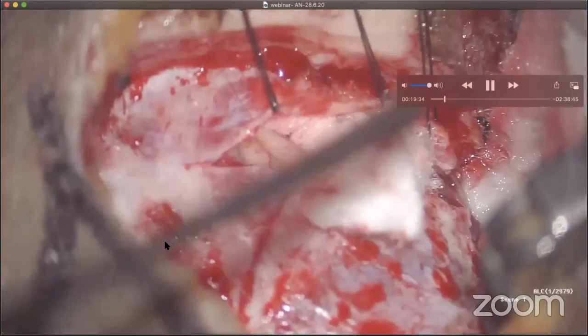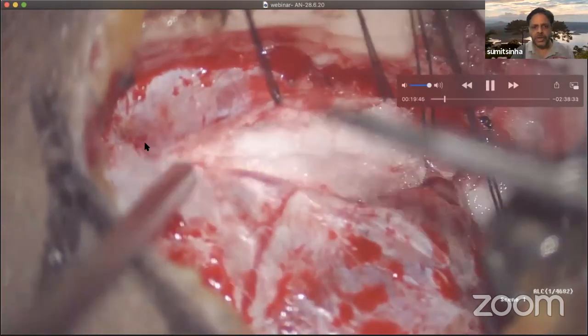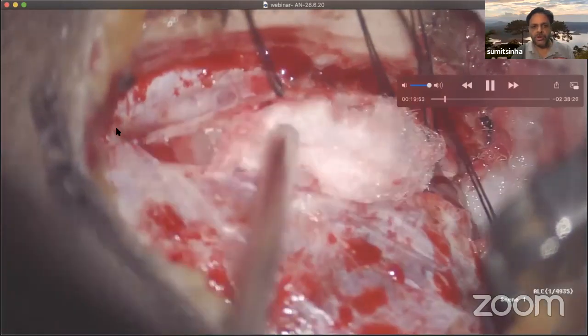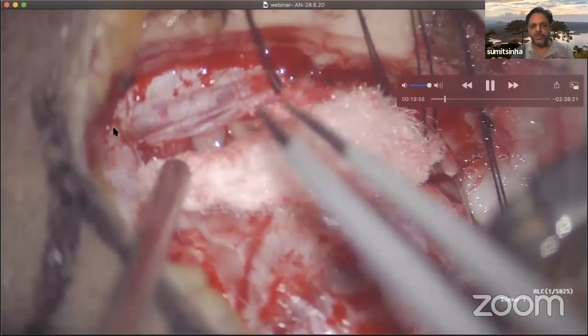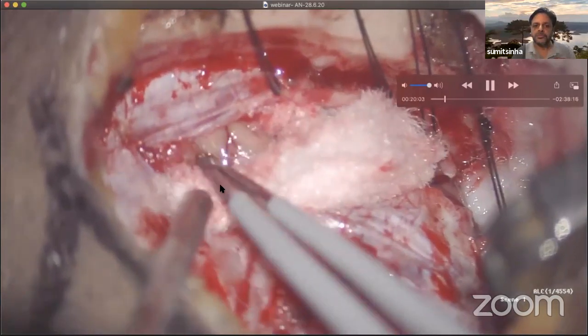Yes. Okay. So now the superior cut is at the junction of the sigmoid and transverse sinus. You have to be very careful not to bump into the sigmoid sinus while making this incision. You have to be slightly 3 or 4 millimeters away from the sinus so as not to injure the sinus.